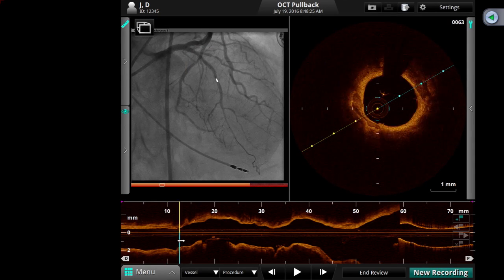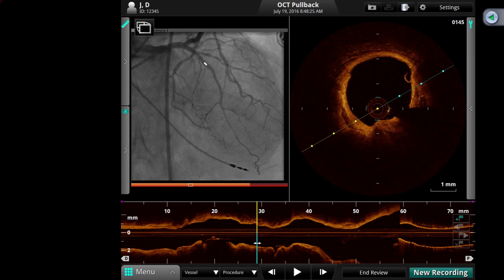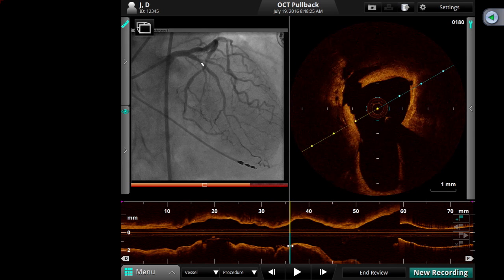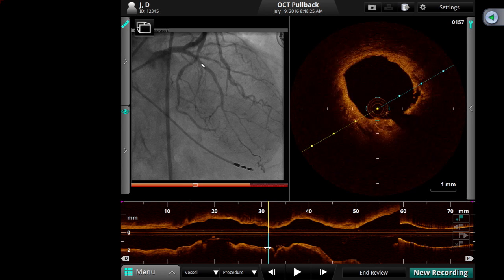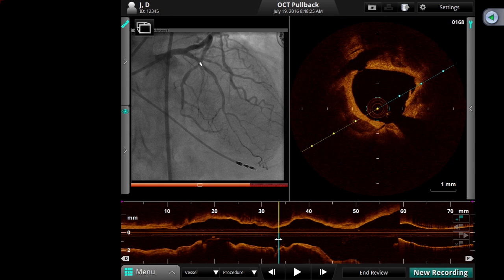I can say what's happening. What are we seeing in the OCT now? Okay, see, concentric. Let's go to the calcium. Looks like 160 degrees, right? Two quadrants of calcium. Not complete. You see that? That's calcium. Well, I'm sure there was much more before the rotablation, but I mean, probably not a lot.